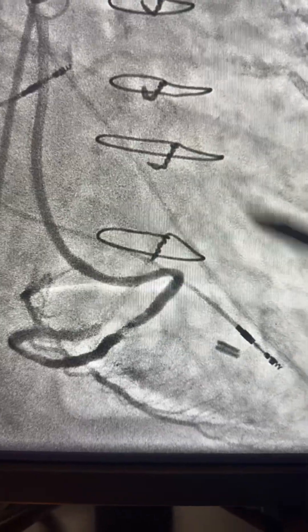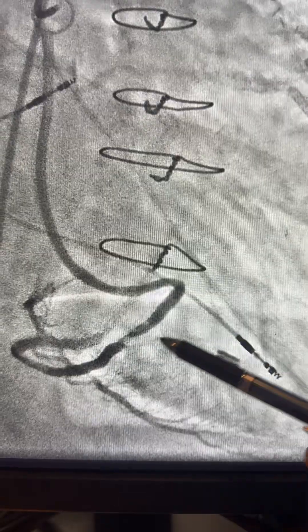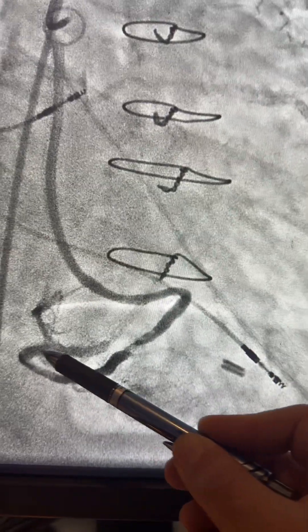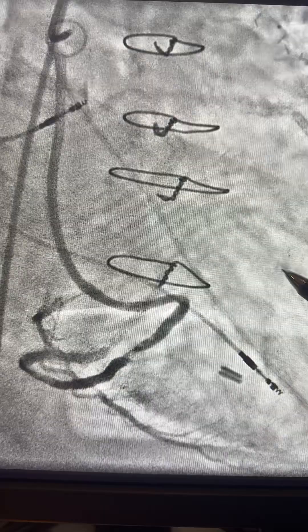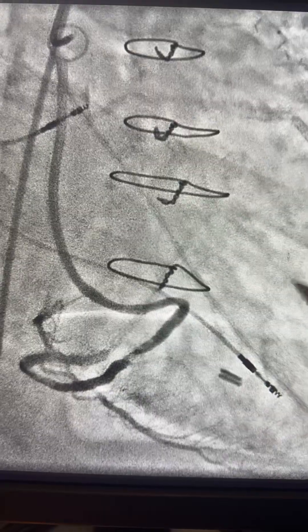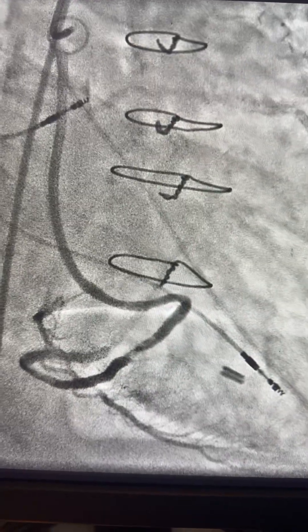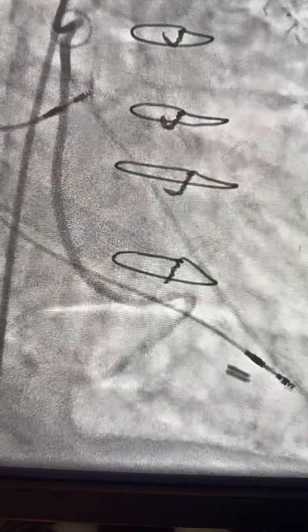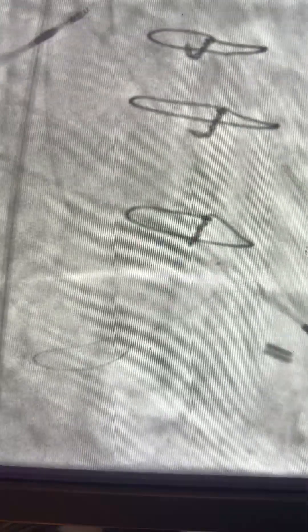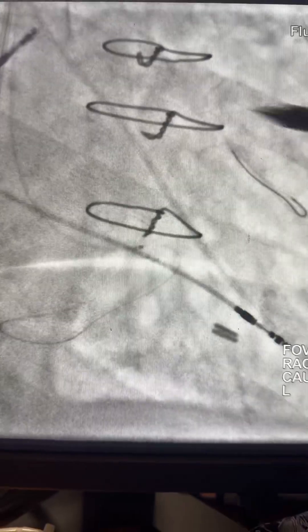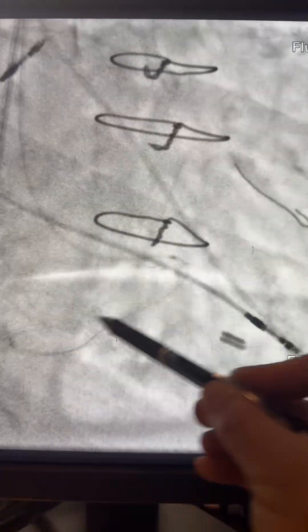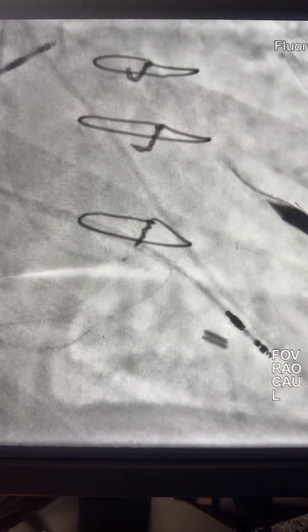We're going to use a long run-through wire and pass all this tortuosity toward the OM. Here is the wire and the Proxis LP catheter — you can see the wire making all these curves up to the OM.